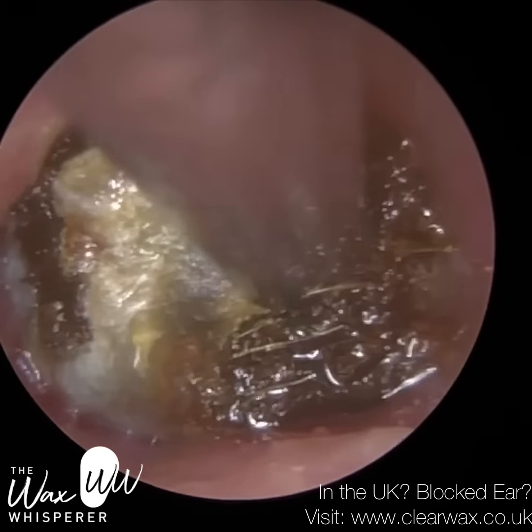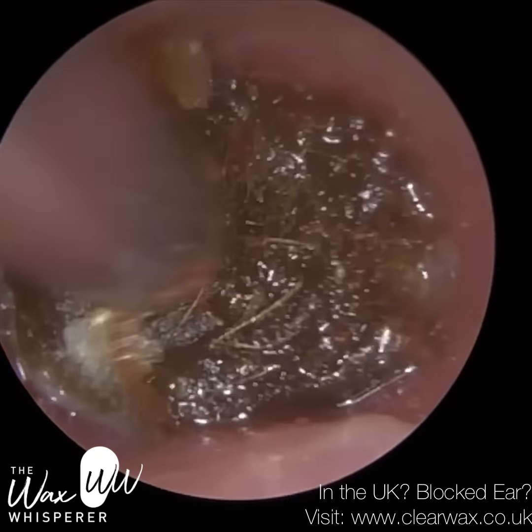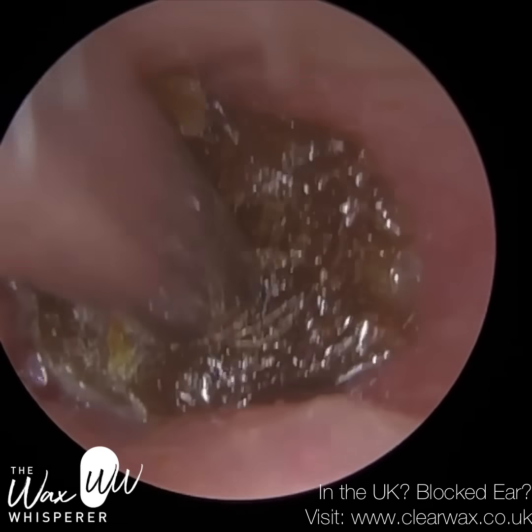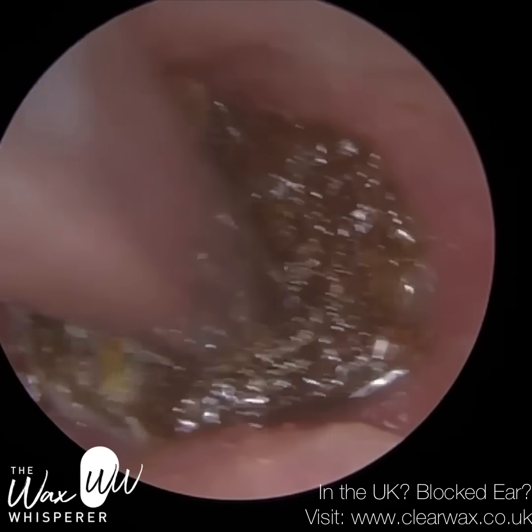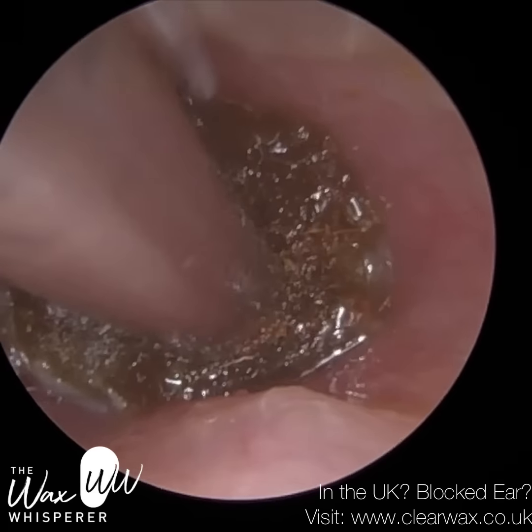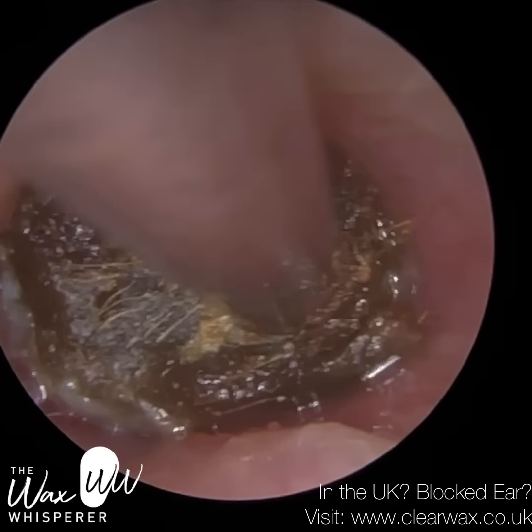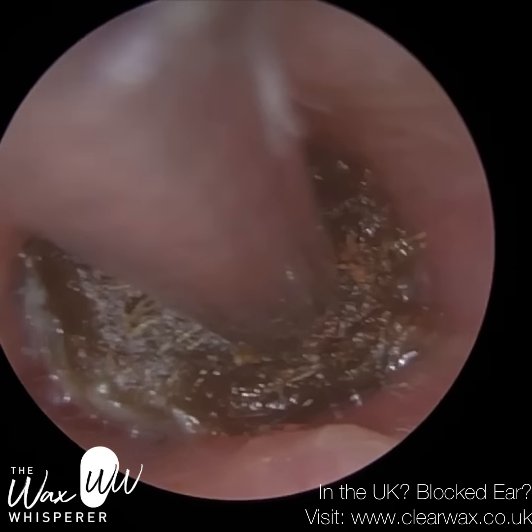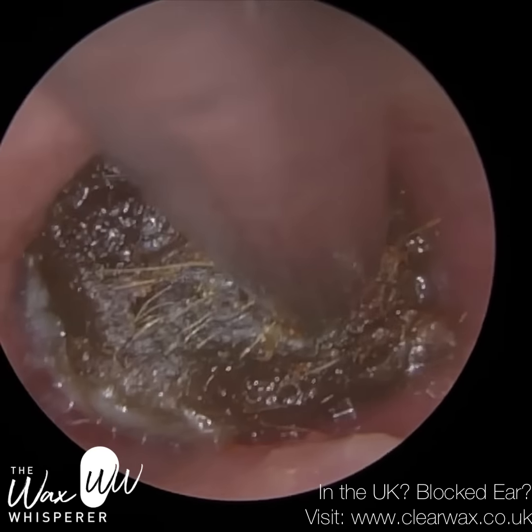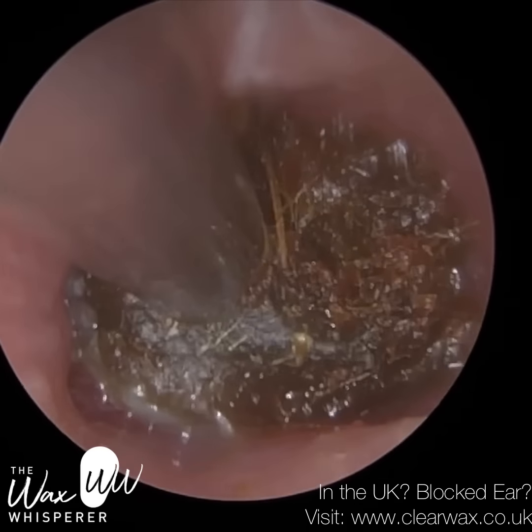And if you look at the playlist I have on Keratosis Obturans, you can see they have one familiar theme. It's the time taken to remove. A normal earwax removal for me, I would say nowadays it's about 5 minutes, but Keratosis Obturans, it's very seldom you can get that done within, if it's a grade 2 and above at least, less than half an hour. It's just a lengthy procedure because you just have to go through the motions of loosening it, detaching it. There's no shortcut really. So we're making good progress here.